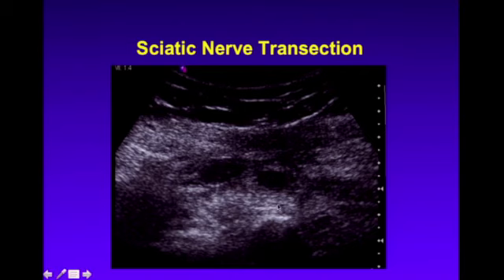This was a young woman who had hamstring surgery, and after surgery had absolutely no function of her sciatic nerve, and she was no longer able to walk. So the surgeon was really, of course, concerned that something had happened to the sciatic nerve.